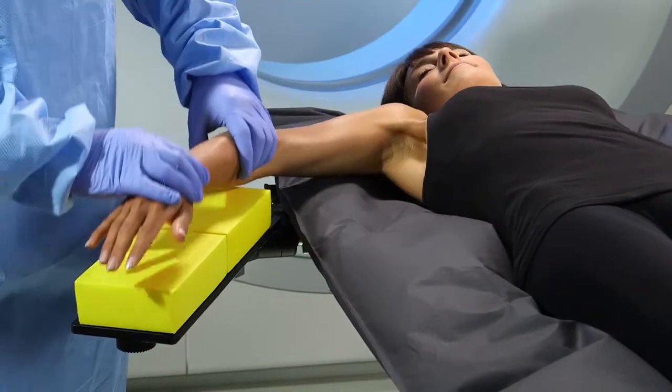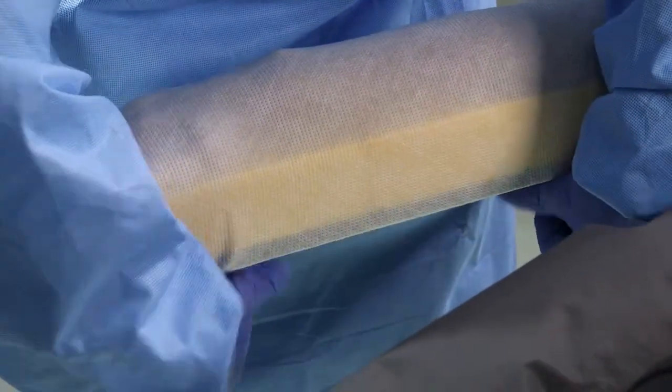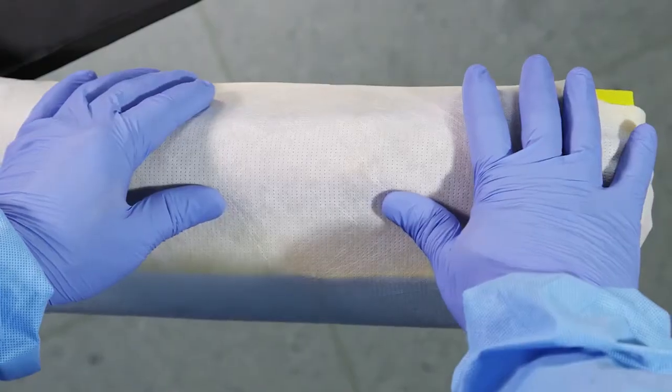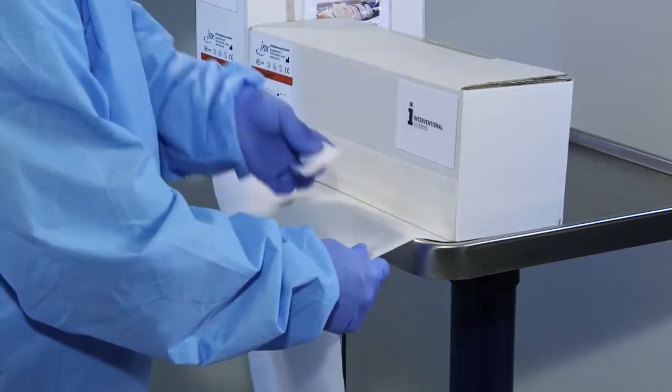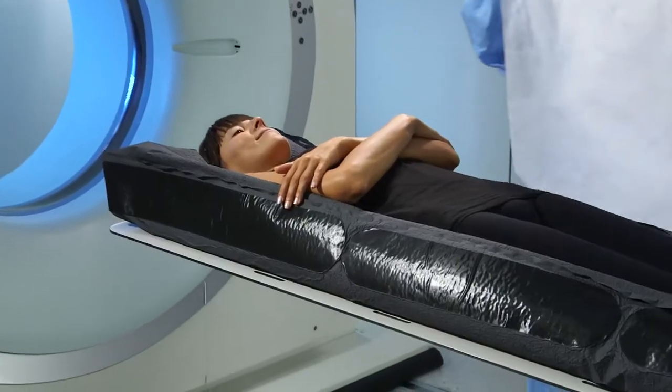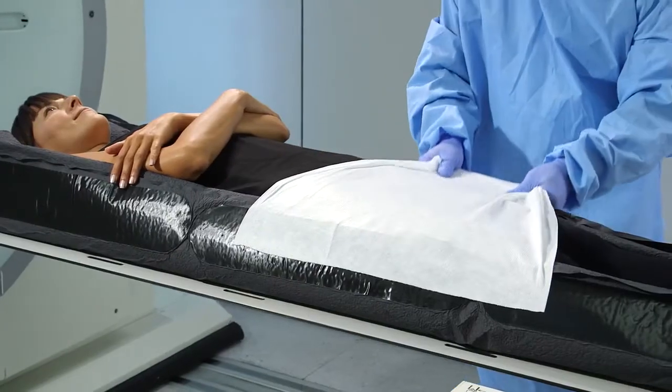Our goal was to develop a revolutionary patient stabilization system that could significantly improve clinical outcomes. iFix is a patient stabilization system comprised of both reusable and disposable components. The comfortable, stretchy fleece is intended for single patient use.